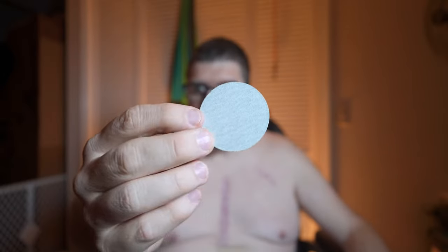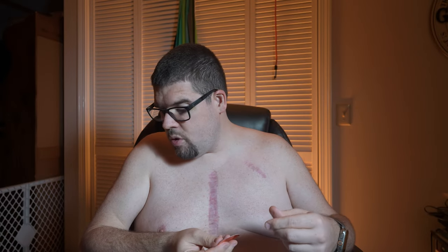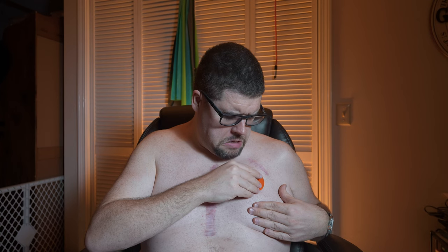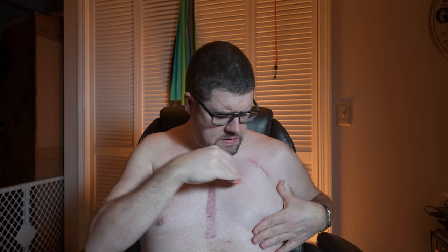That is literally sandpaper. I'm going to do this — one, two, three, four, five... I just hit my scar. That sucked. I'm doing a few extra strokes because I'm paranoid — the first time I ever wore this, after day four the thing nearly fell off and I literally had to tape it on myself with medical tape. So if I can try my best to get this to stay on, I'm going to do it.